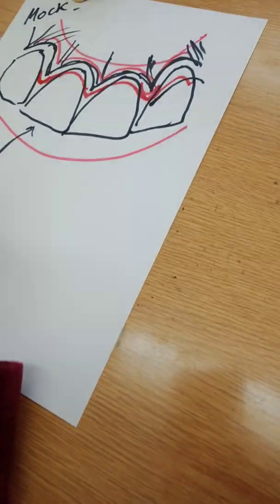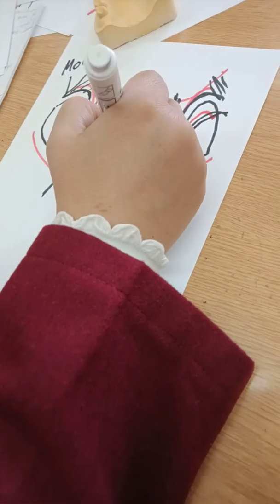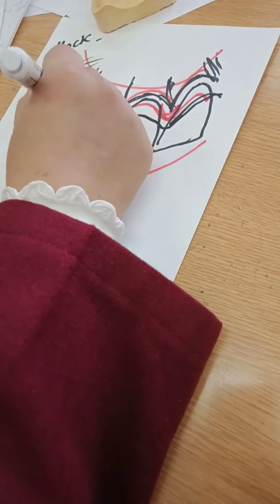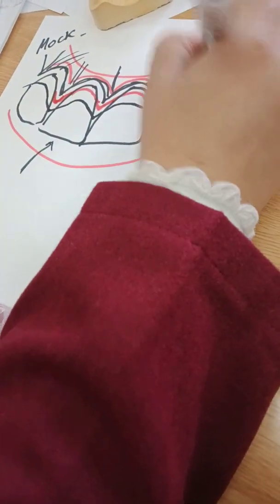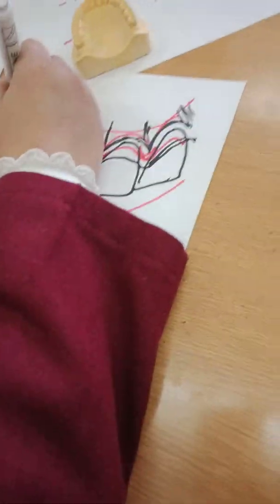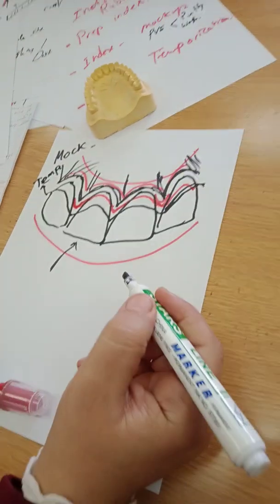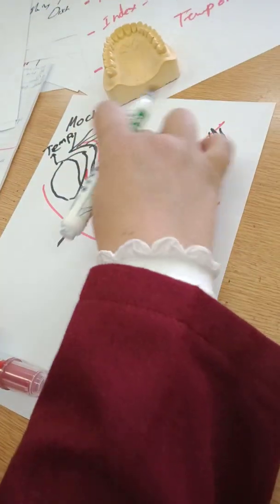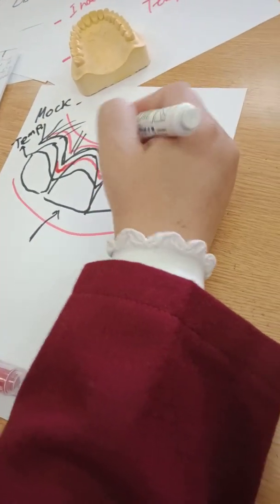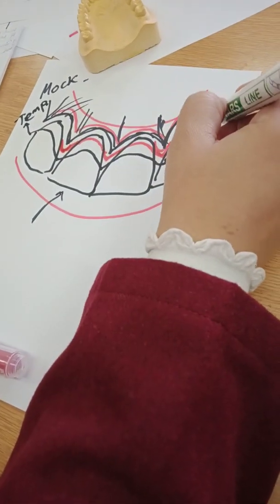This index, we cut it below the marginal gingiva and below the papilla by 1 millimeter. This is which one? Temporization. Temporization index. We cut it the same way, with a blade or with a burr. It's the same morphology.